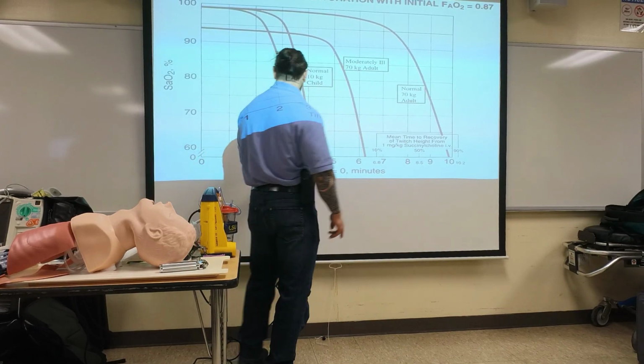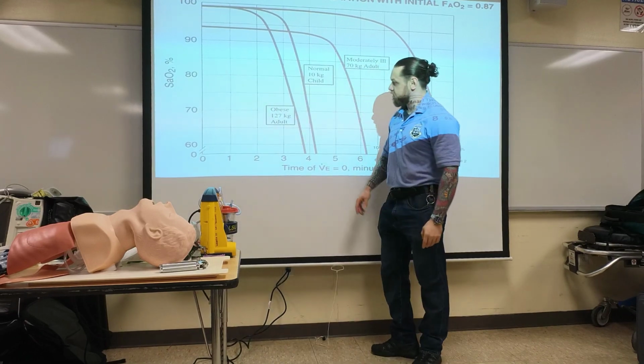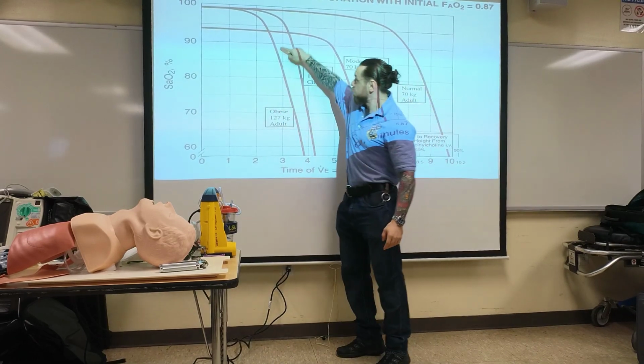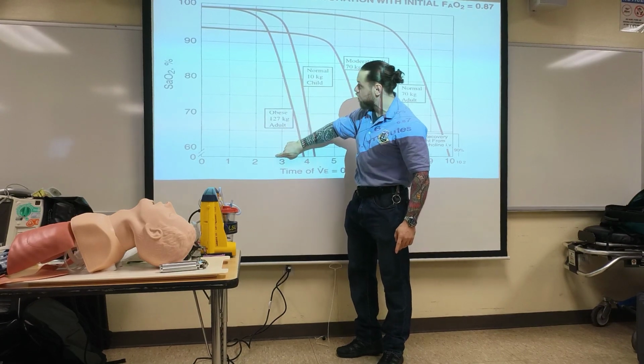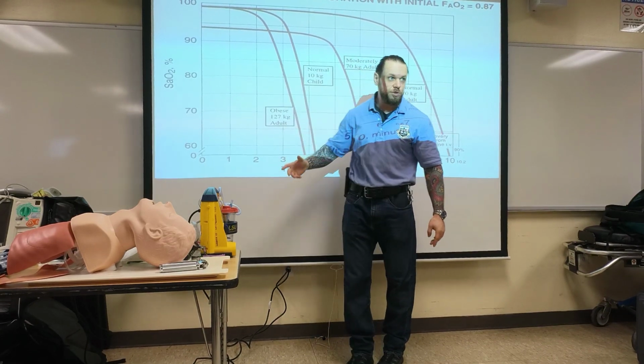And then let's say the person you're gonna get is this obese patient, right? And we're gonna go to this 90 mark, and we're gonna go down, right? You have a little over 2 minutes. So at no point do you have 20 seconds.